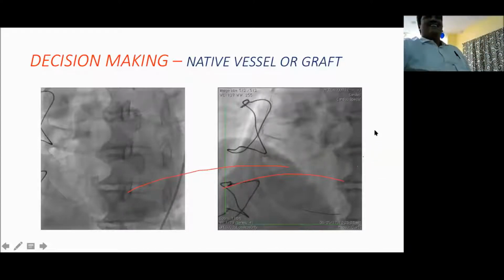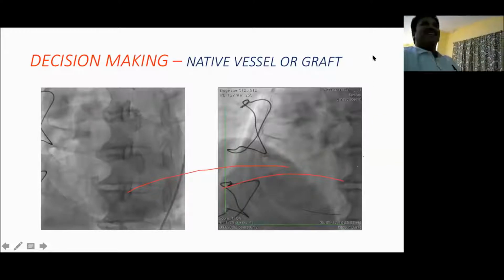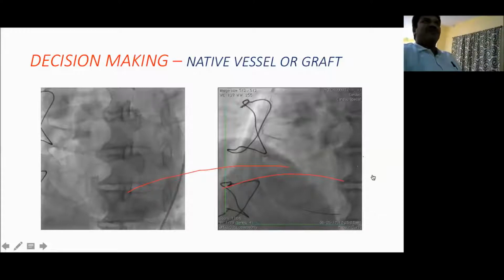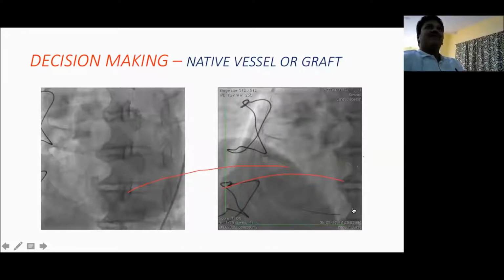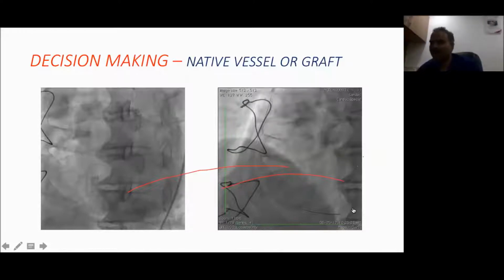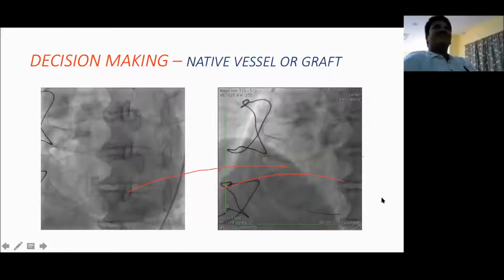Nice actually. I really enjoyed the presentation. The take-home point is really to understand where the graft vessels are arising from, and how they are different from the native coronaries. So from next time I will probably think of only a selective angiogram even for the graft, instead of going for a pigtail aortic root angio. In the last 5 years, I never did a non-selective angiogram. That's great. We'll try to do that.